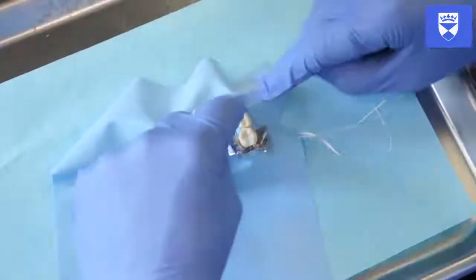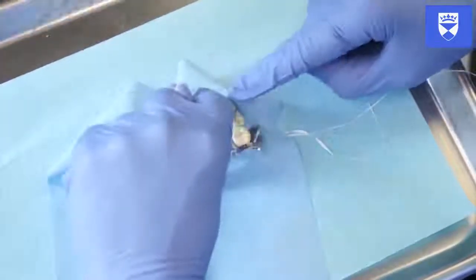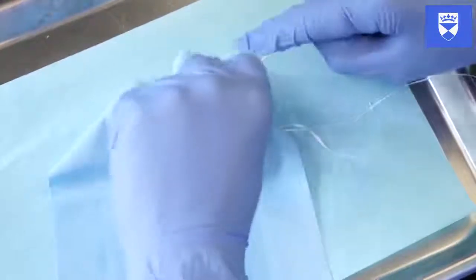Ensure the dam is fully seated by flossing through the contacts. The dam can further be secured using rubber wedging material.